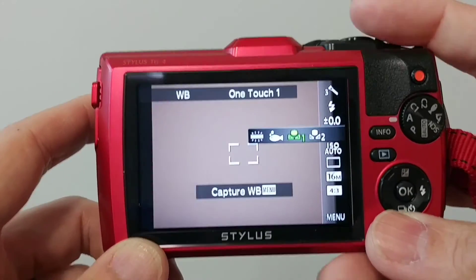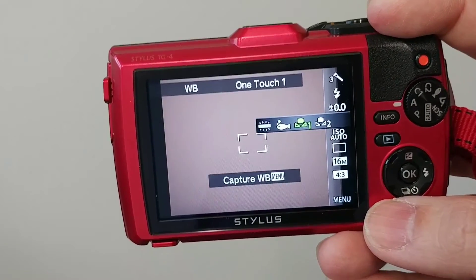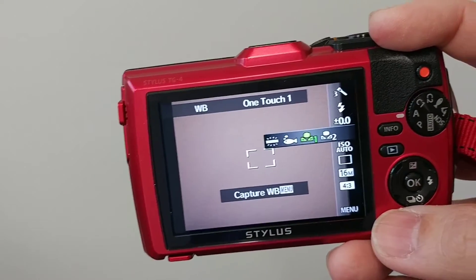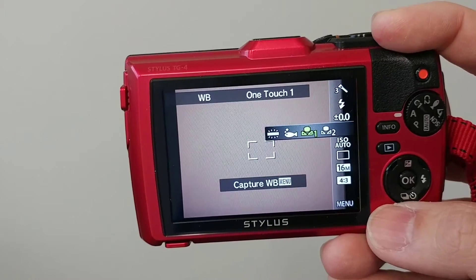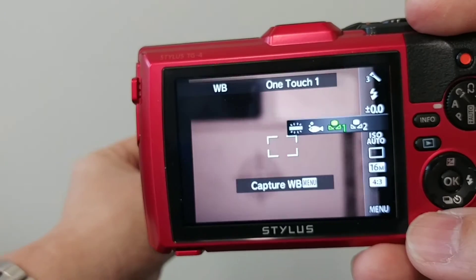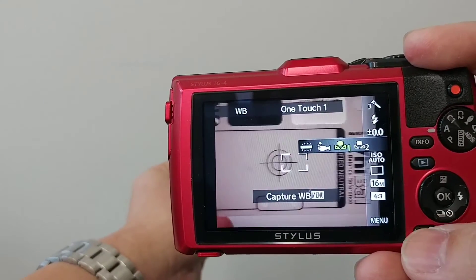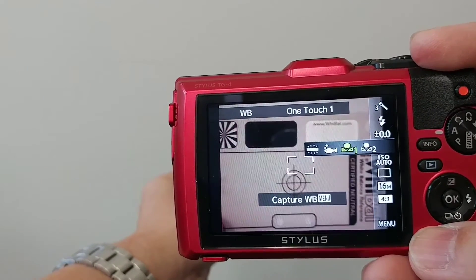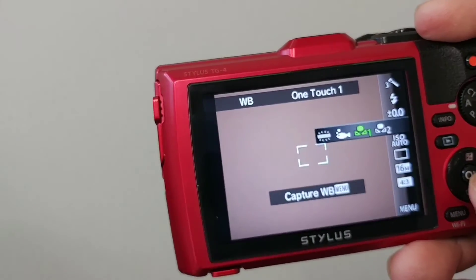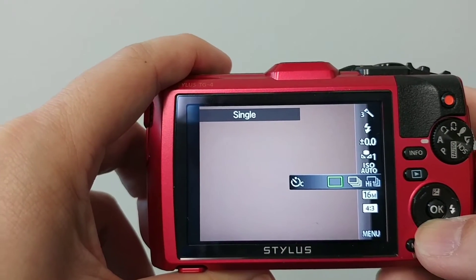For white balance, I set it to custom — this is an advanced technique that not many people do, but it's the only way I'm able to get accurate color with this camera. The main criticism I hear from people who show me pictures is that the color is off. There's an easy fix: a quality white card costs about $20. I put it in front of the camera, push the menu button, and it captures the white balance. It analyzes the gray and now it will have accurate color.